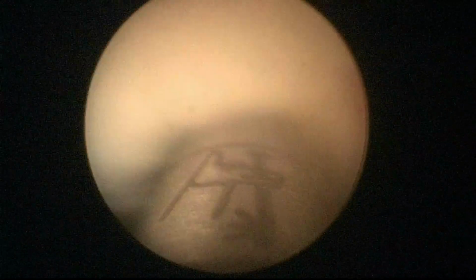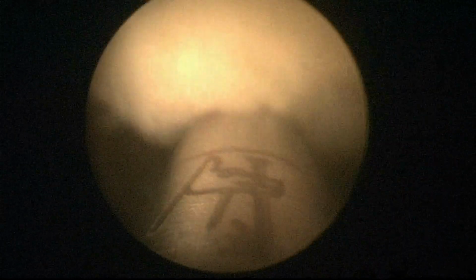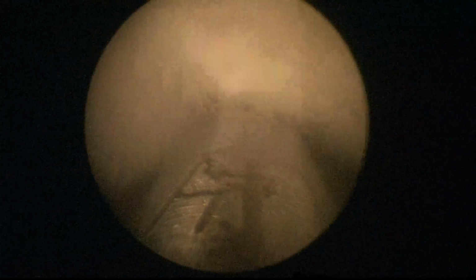This piranha morcellator is wonderful, as it chews the tissue very fast, and in these very large glands it's going to take a while. We usually take out about 10 grams per minute, which means that if this is a 160 adenoma, for example, it'll take us around 16 minutes, we will see. This providing that the morcellation goes well and it's efficient, but it's looking very good.